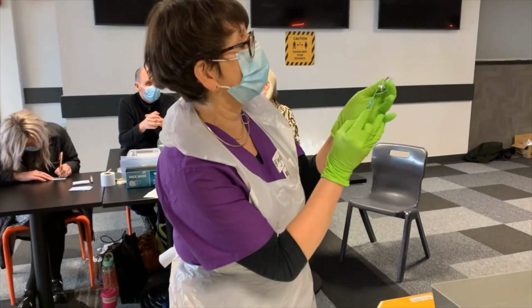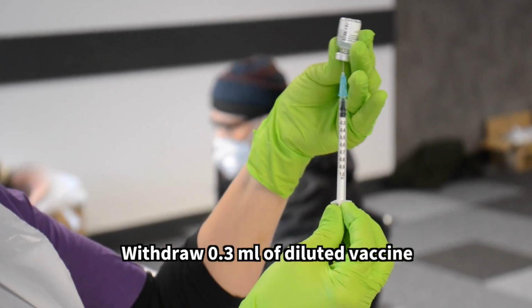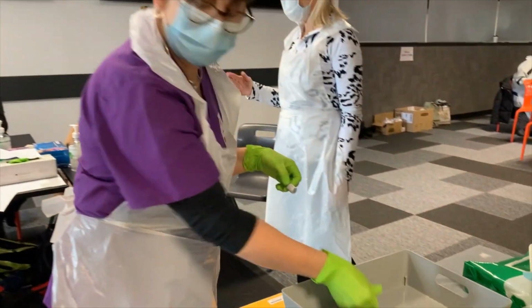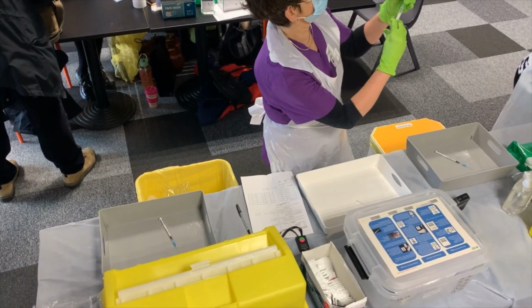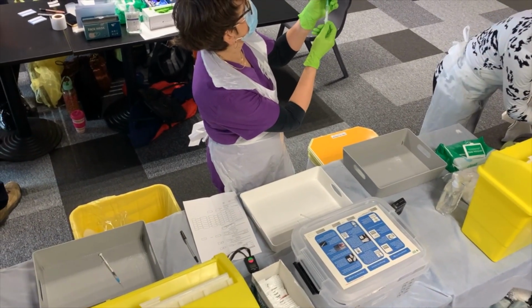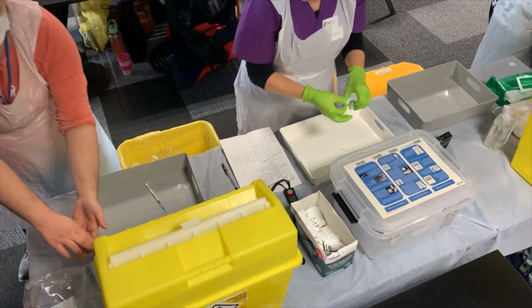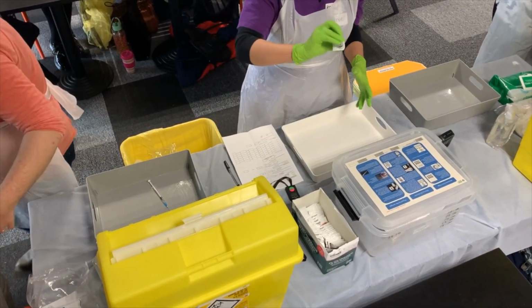Pick up the syringe and blue needle and withdraw 0.3 millilitres of diluted vaccine from the vial. Place this in the kidney dish next to the vaccinator. The vaccinator will pick the syringe up from here. Since the needles cannot be changed or resheathed, this process is to reduce the risk of injury. After 6 syringes have been used and filled, repeat the process with a new vial.